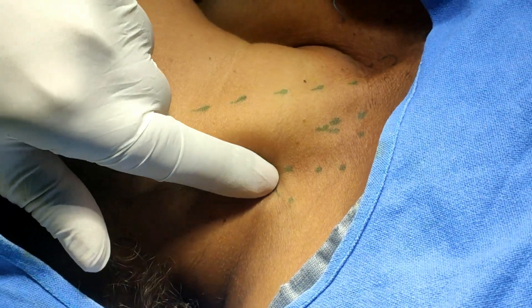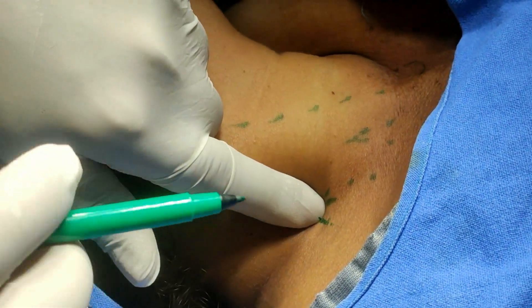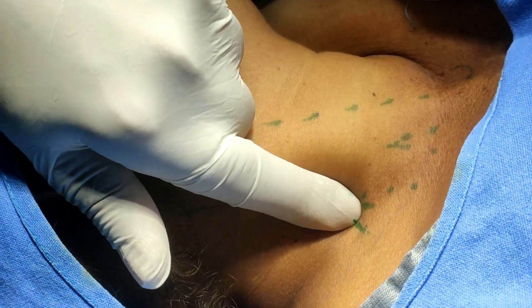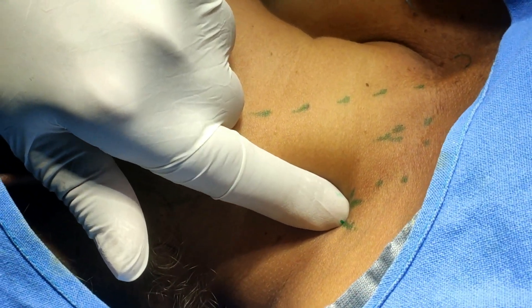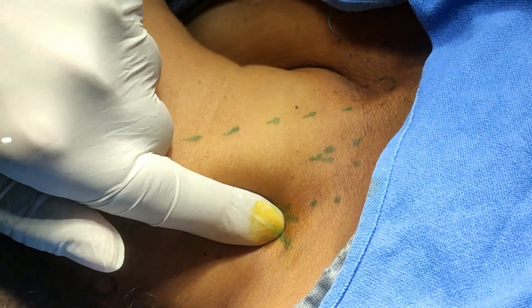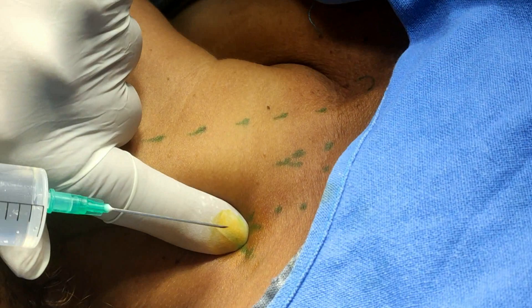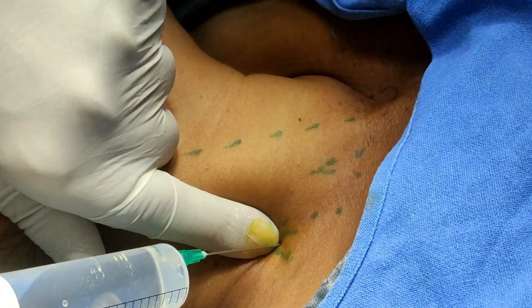Now feel for the scalenus anticus and the groove between the scalenus anticus and medius. So this is the site of entry of the needle. Just stabilize this point of entry. Apply a little betadine here, and then insert the needle in the interscalene cleft just above the clavicle.